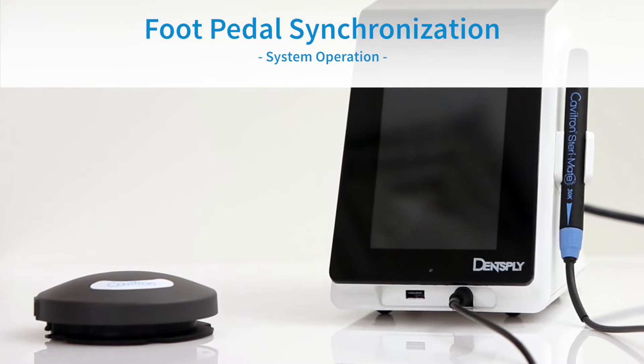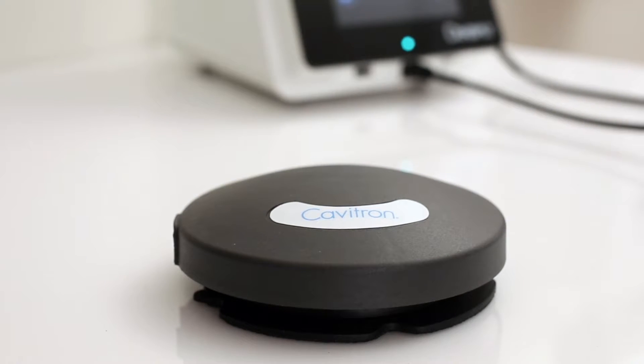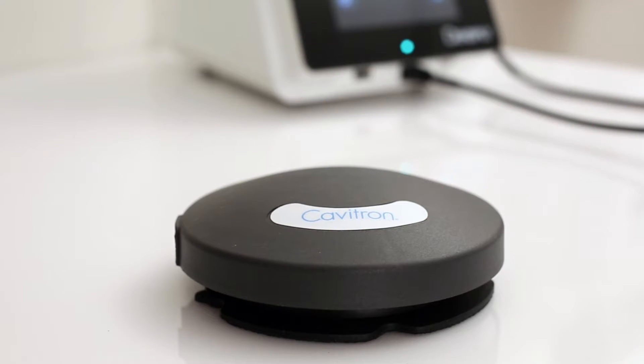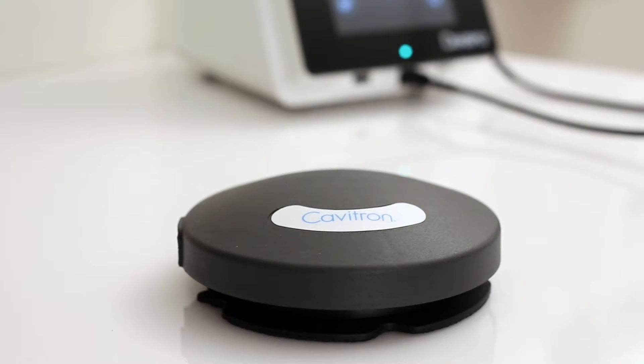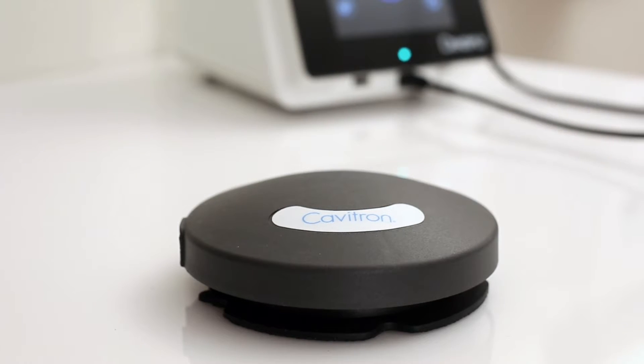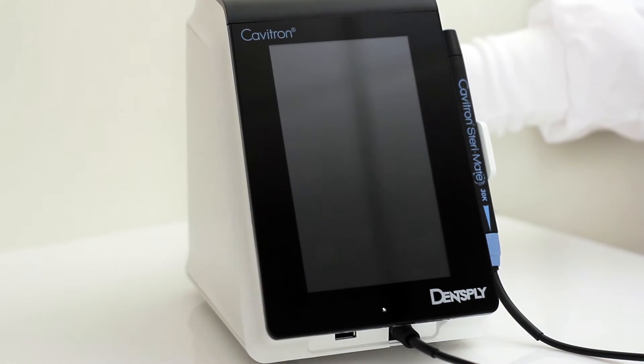Tap-On Foot Pedal Synchronization: The tap-on wireless rechargeable foot pedal supplied with your system has been factory synchronized with the base unit. Should a replacement foot pedal be necessary, synchronization will be required prior to system operation. Users should maintain a distance of no more than 10 feet between the base unit and tap-on foot pedal during the synchronization process. To synchronize the foot pedal, begin by turning on the main power switch located at the rear of the system to the on position.